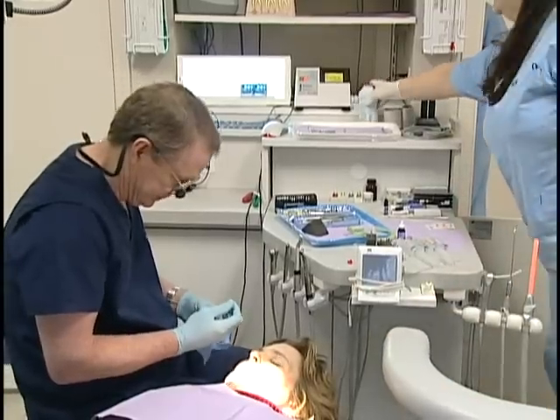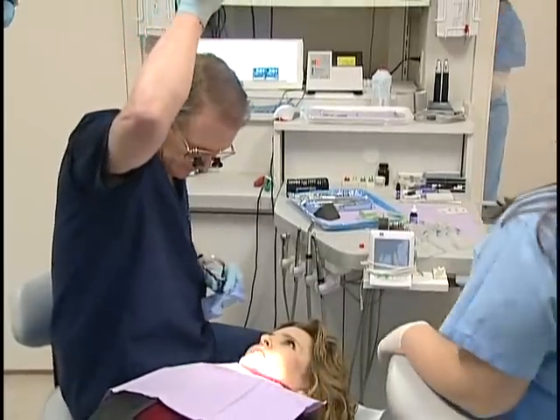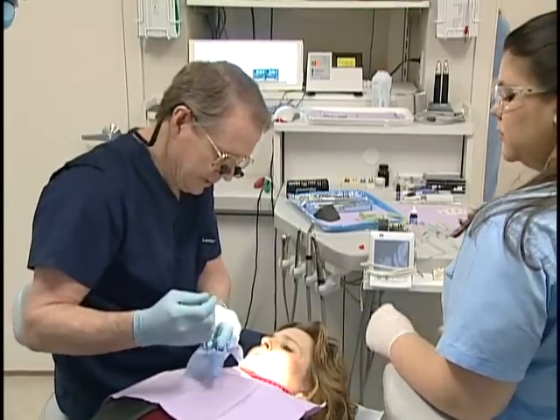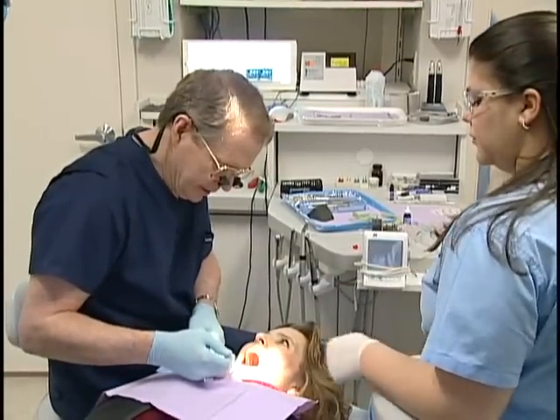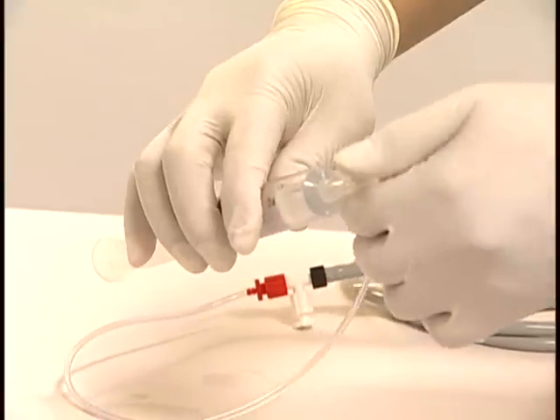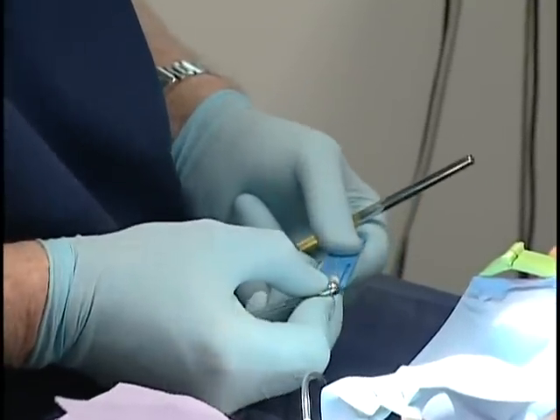Dr. Bill Wildy, endodontist and founder of Lightspeed Endodontics, along with his assistant Jennifer, will show us how to use the Endovac to achieve maximum microbial disinfection by using the master delivery tip, the macro cannula, and the micro cannula.